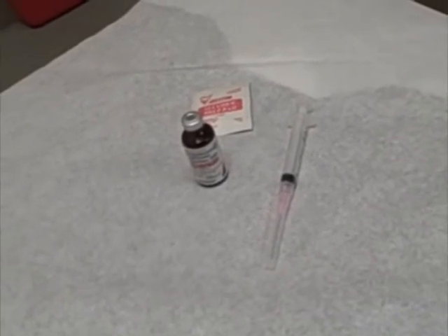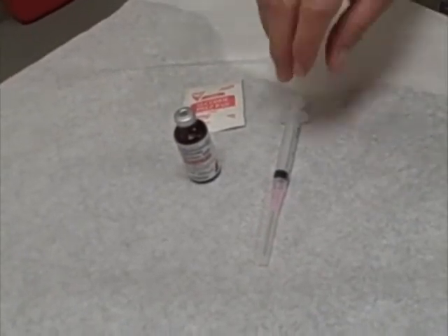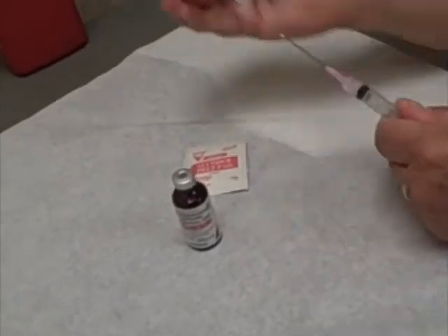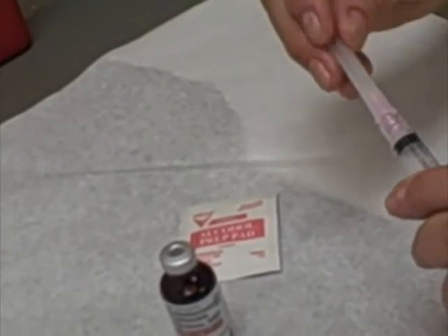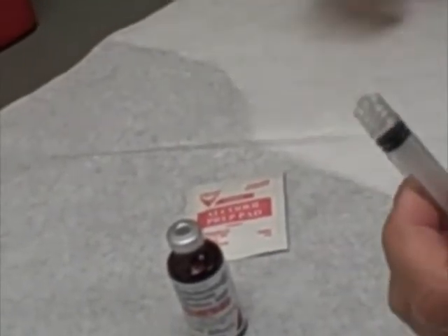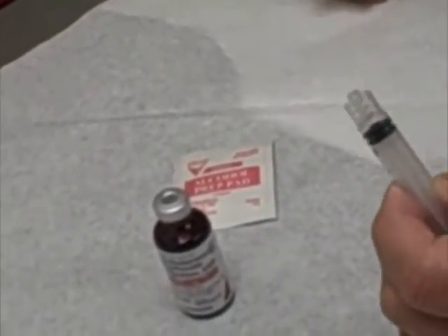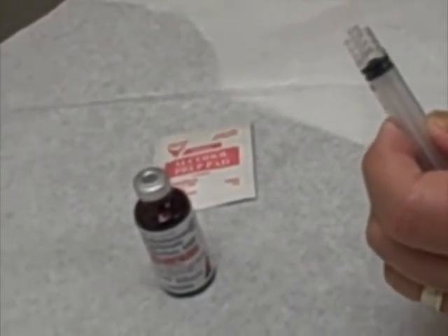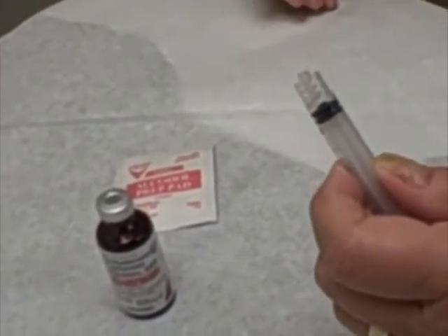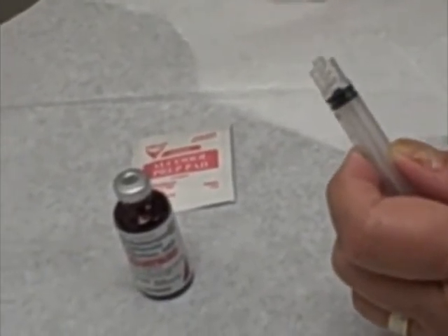So I just want to show you briefly, sometimes we use a larger needle to draw the medication out. And then what you can do once the medication is in is switch on a smaller needle. But remember, however you do it, it will be, with the smaller needle, a little bit more resistant when you try to push it in the muscle. So I'm just going to draw some up to show you some of the techniques you may have to use when drawing up testosterone.